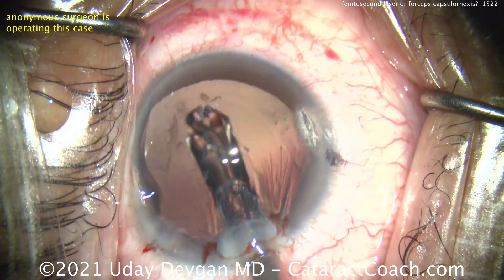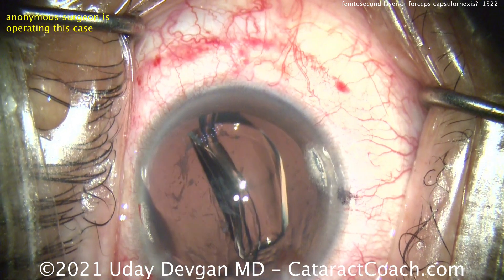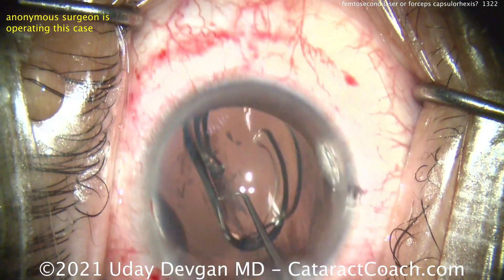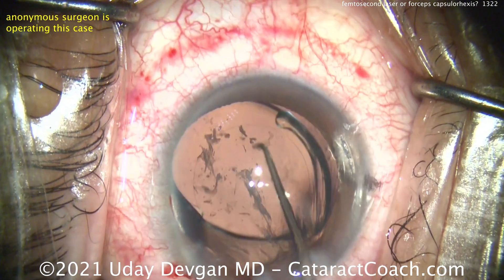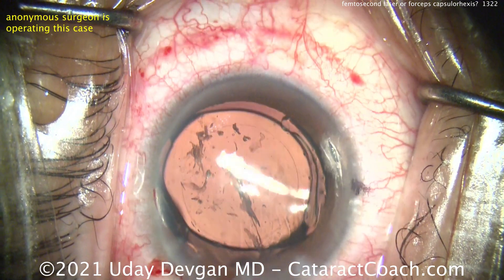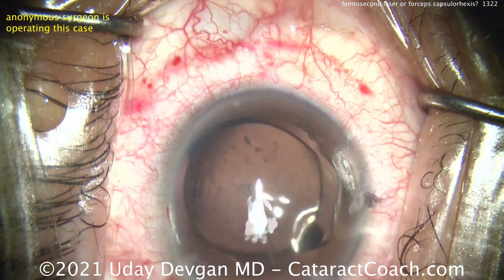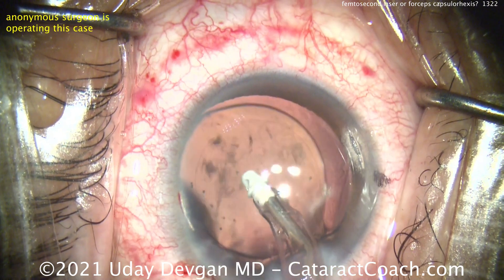Here at the end of the case, delivering the lens — there's the lens going into the capsule bag. It'll have a nice overlap of the optic by that capsulorrhexis. So while they both look about the same here, remember: if you look at scanning electron micrographs of the edge of that capsulotomy made with the femtosecond laser, you'll see it looks like a postage stamp with perforated edges.